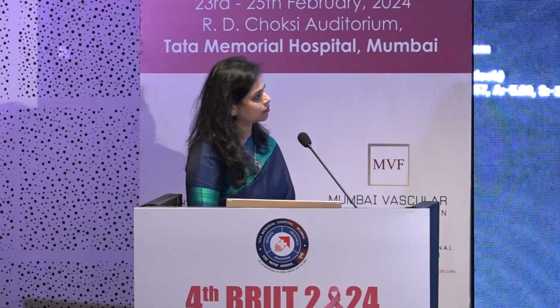I can just once cross-check to see what is the approximate distance from the skin surface to the center of the point, and that is about exactly 4.3 centimeters. So we have a match with our manual calibration as well as the auto calibration by the software. And now our points to take when we go inside the MRI room are the localizer, where it is, which slot we take. This is in the inner aspect, and the depths that we need to go in.